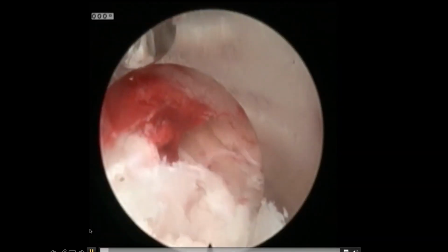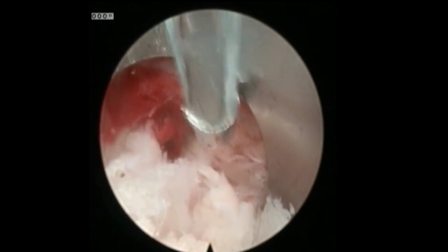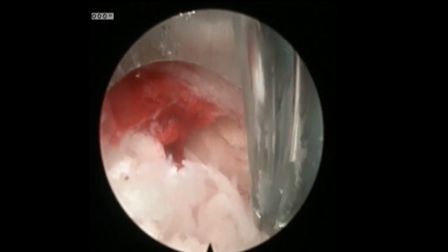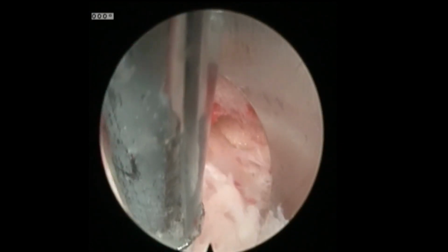Up here at the 11 to 12 o'clock is what Dr. Wagner calls a Wagner arch. This is bone that has been resected. You see the pulsating epidural fat right there, and this stuff out here is all lateral stuff in the facet joint, facet capsule.